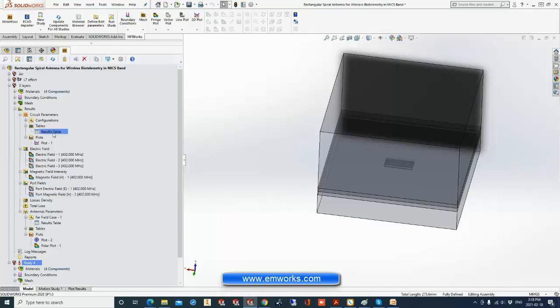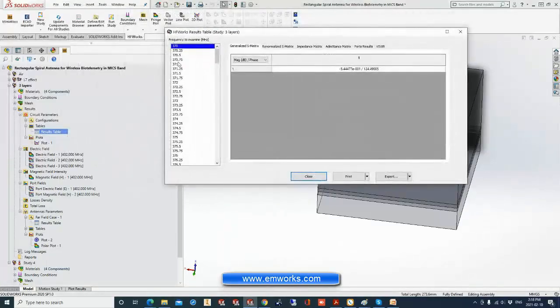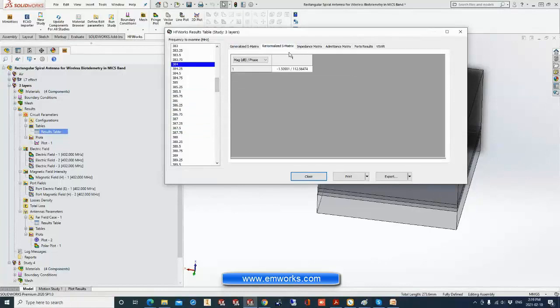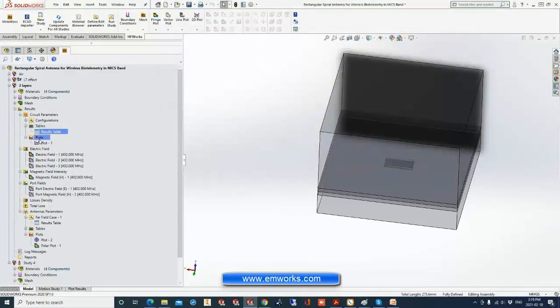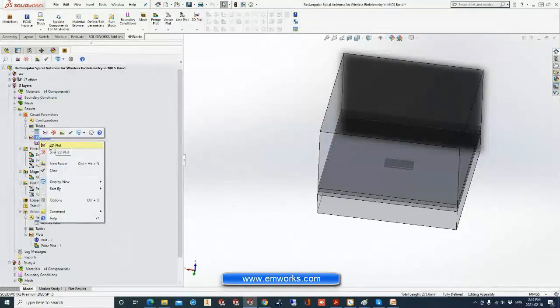Let's check first the results table here. We have the frequency list on the left side. So we solved it from 370 to 420 megahertz. And we can check on the right side the S parameter related to each frequency. We can check the normalized S matrix, impedance matrix, the port results, VSWR, and we can plot all of those quantities in 2D format. Come here and you create a 2D plot.